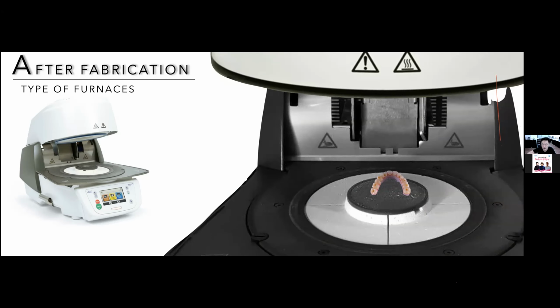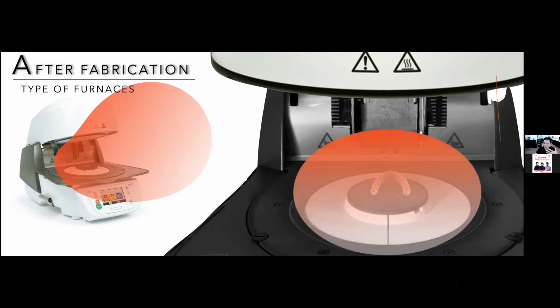But if you change it and make your anterior central incisor close to the front, maybe it releases heat too fast. It's dangerous, and you will get breakage in this area. So please don't cool too fast, and please change the angle and the position when you use this type of furnace. You see, in this type of furnace, the heat will stay in the back, and the front releases it very fast. So this is very dangerous.